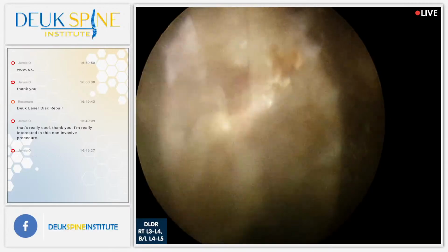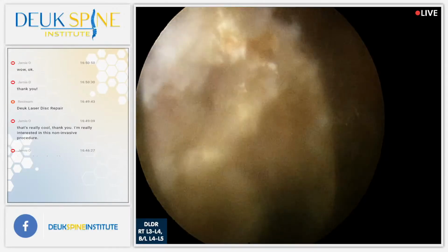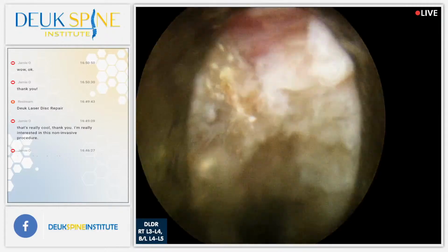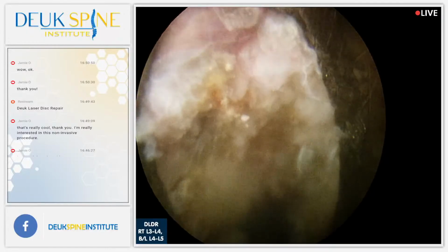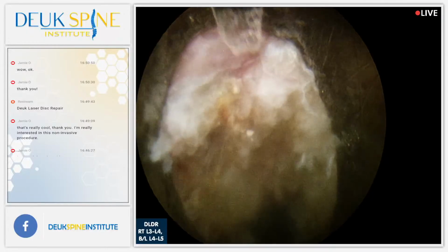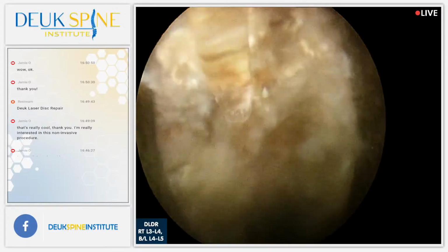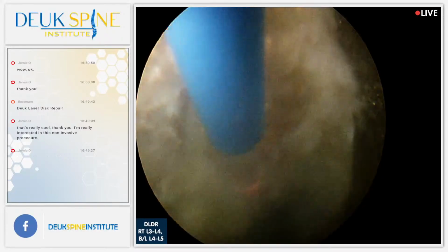We can do those surgeries any day we want. We have the ability, the equipment, the training, the technique. I've personally done thousands of them. But our customers don't want the old-fashioned stuff. Look at the inflammation tissue right there. It's pink. That is where the pain comes from, right there. And the whole core of this tear.